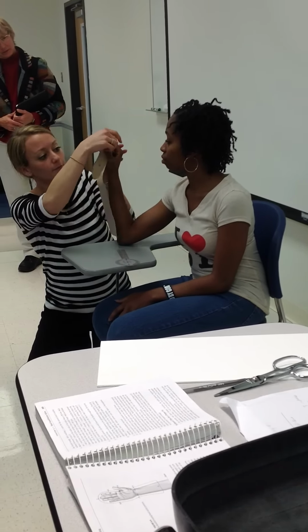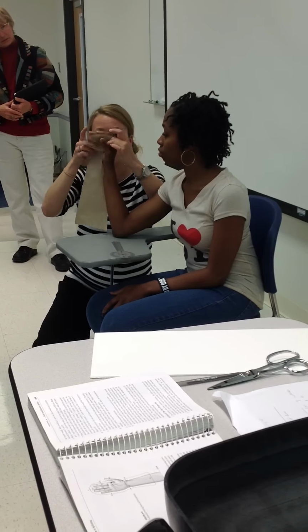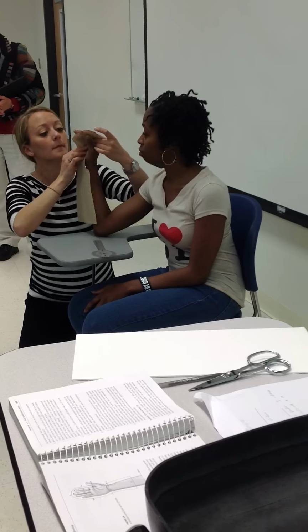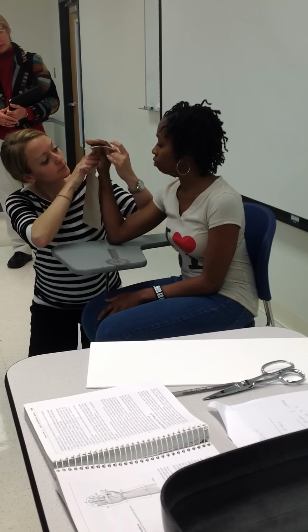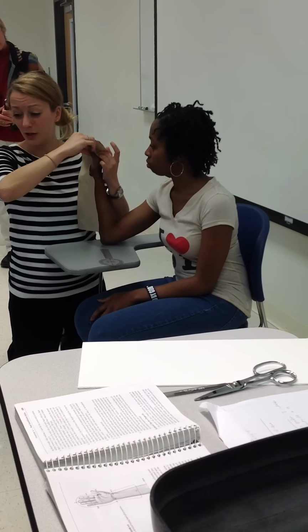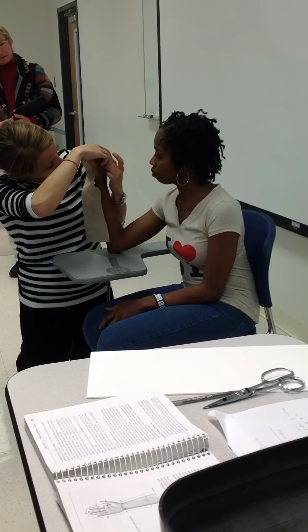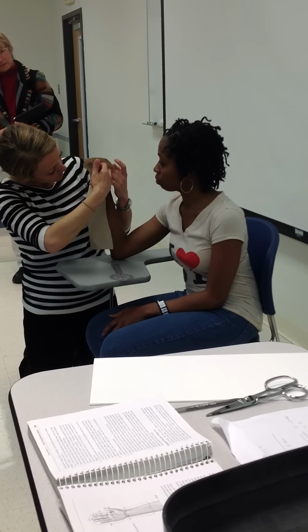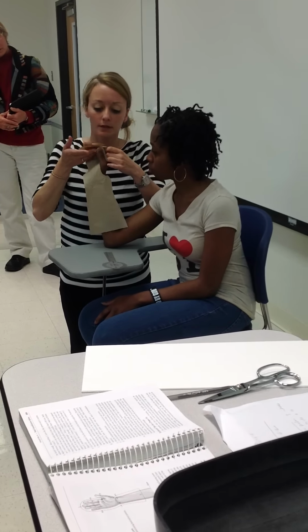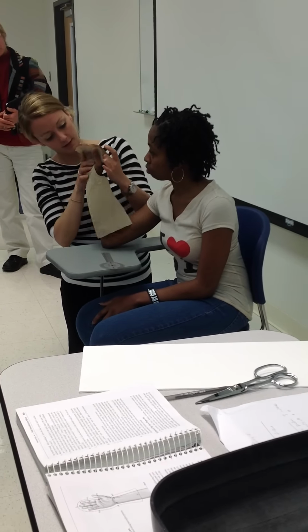All right, so when I first start, I'm going to get my thumb portion first. I'm really coming into the web space. Okay, so the thumb looks like it's going to be pretty good. And I know that it's going to stretch a little bit, but not too much. But I got to make sure that it's going to be at least long enough. Could probably make it a little bit, but I'll just pull it a little bit longer, so that's pretty good there.